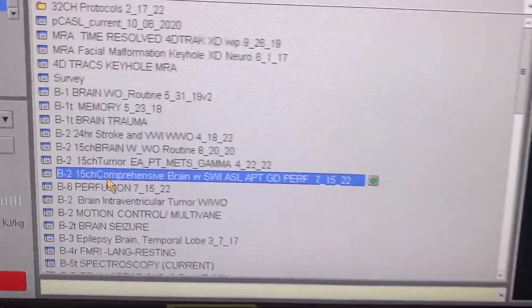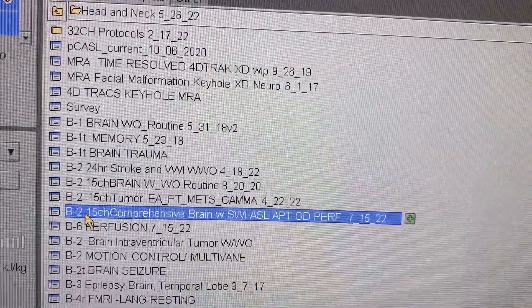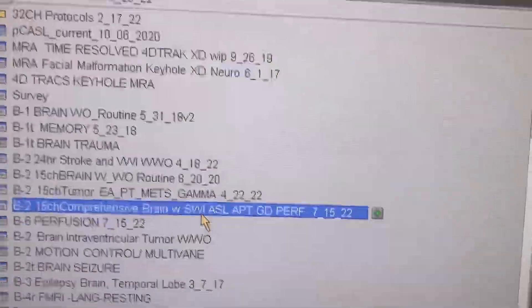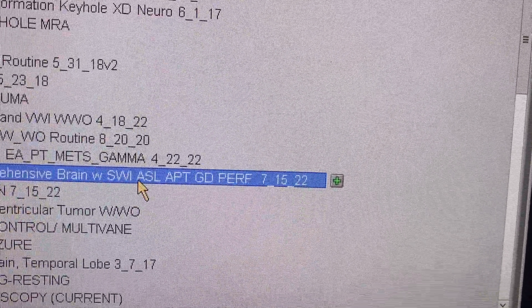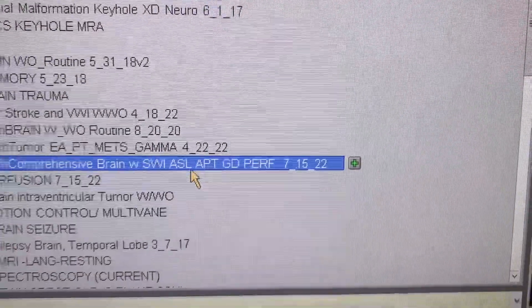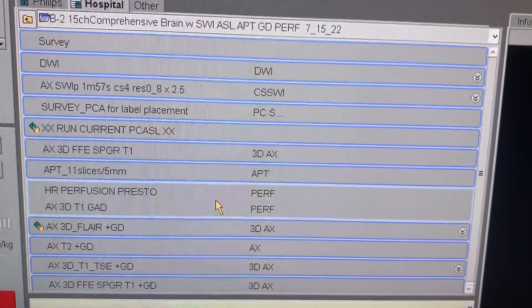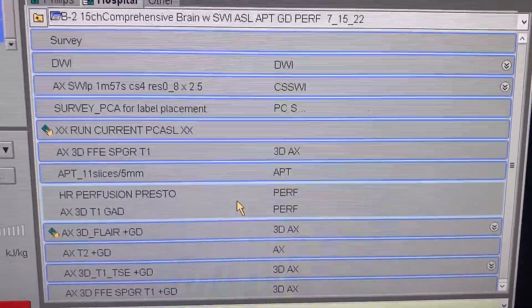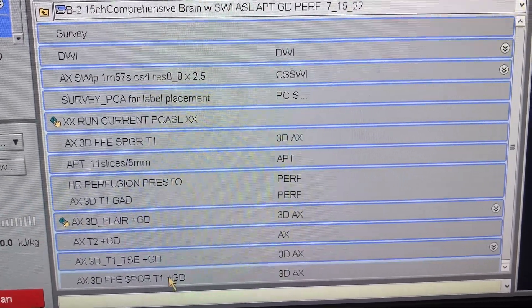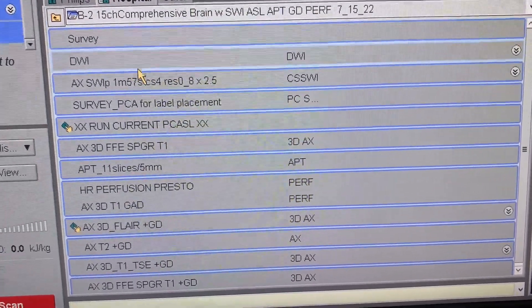Here is the protocol — it's the B2 comprehensive brain protocol, and it also includes SWI, ASL, and APT sequences. Select this protocol; it could be for 1.5 Tesla or 3T.